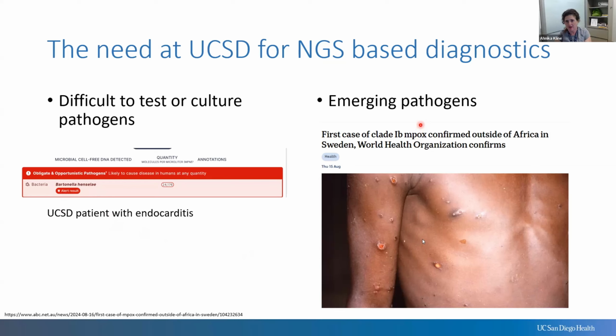for monkeypox virus. But before this, the epidemic monkeypox that we have been dealing with in the last 2 years has been clade 2 of monkeypox, which is thought to be less virulent. And now there has been clade 1b, the more virulent monkeypox. So this is a potentially emerging pathogen, and a diagnostic might be able to distinguish the clades from each other if you could get enough of the reads of the sequences.